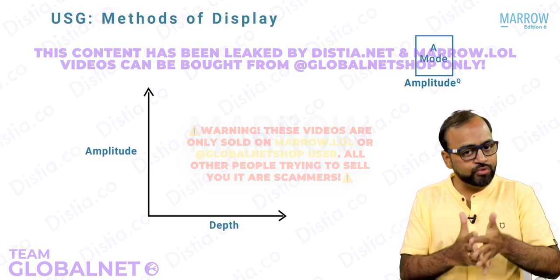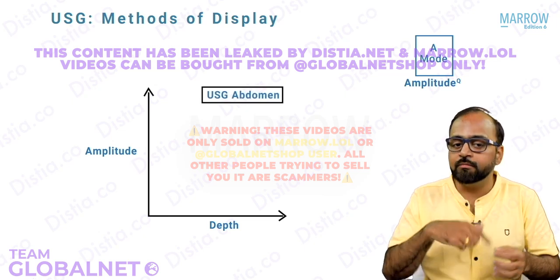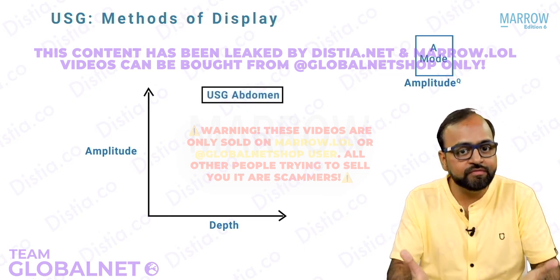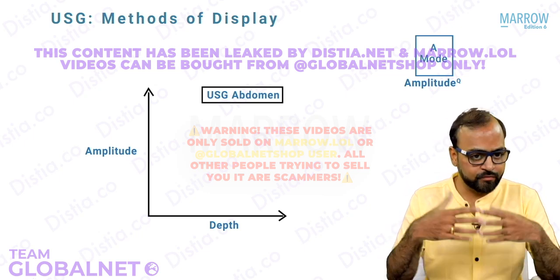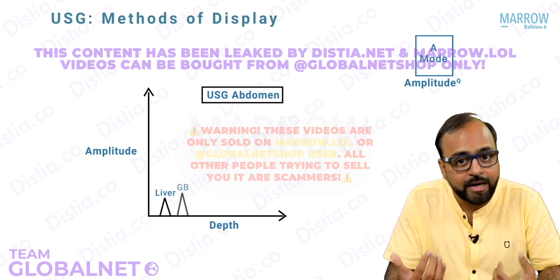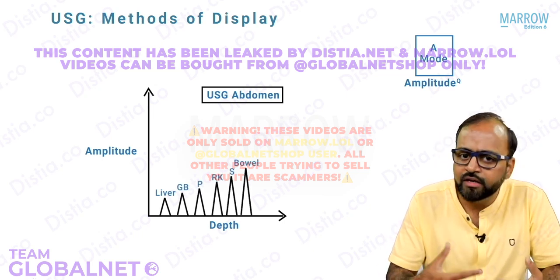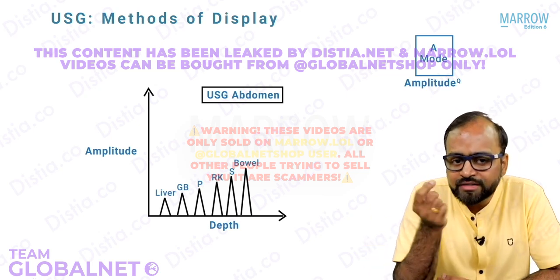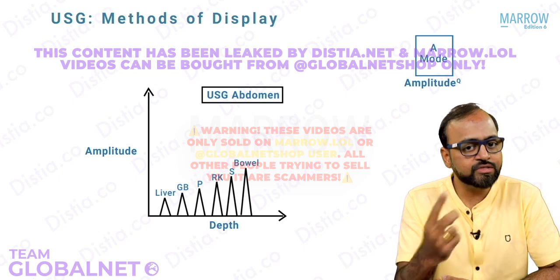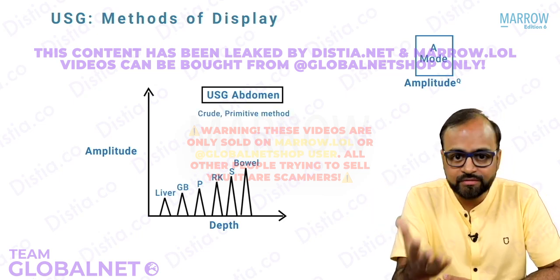Just imagine if I use this for, say, abdomen ultrasound, I will have multiple peaks because there are so many reflecting surfaces in the abdomen, right? In abdomen ultrasound, say I'll get a peak arising from liver, gallbladder, pancreas, right? I'll get it from kidneys, spleen, bowel, lymph nodes, blood vessels and whatnot. Is it possible for me to just look at this graph and say, oh, this is liver, this is gallbladder, this is pancreas? No. Do you realize how crude, how primitive this method is?